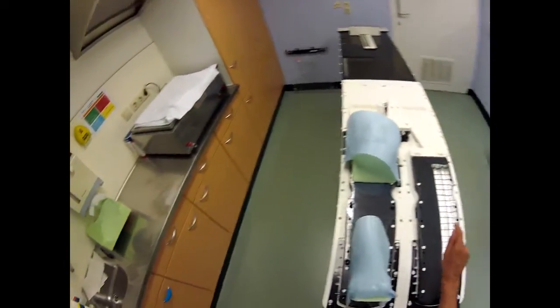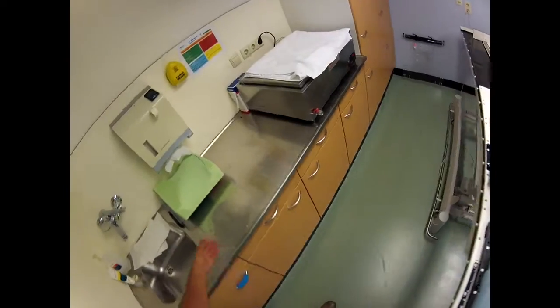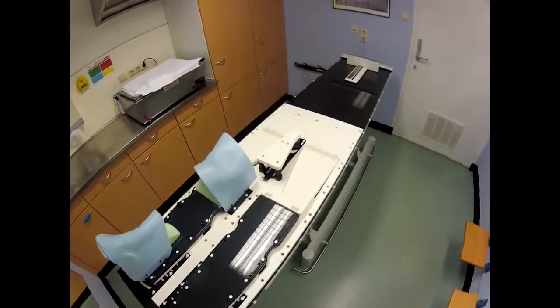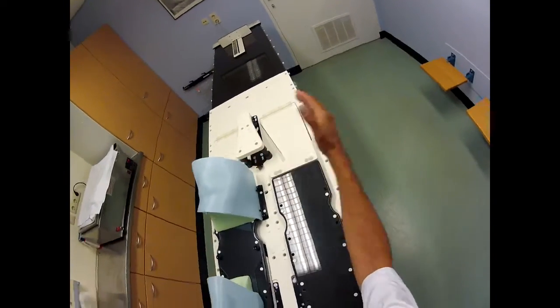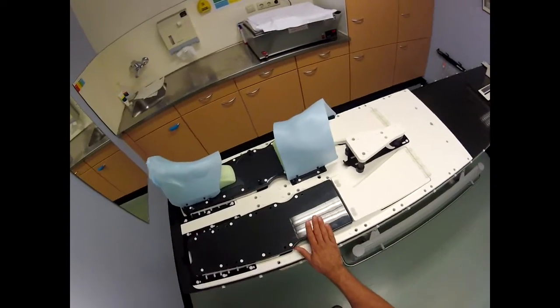Maybe you remember from the last video: our doctors are very fond of the frog position. They don't want this leg up — they want the leg a little bit sideways. And of course that's a problem with this device.